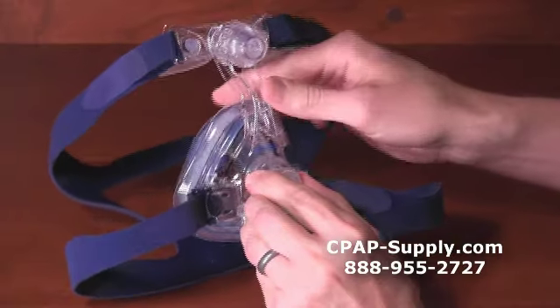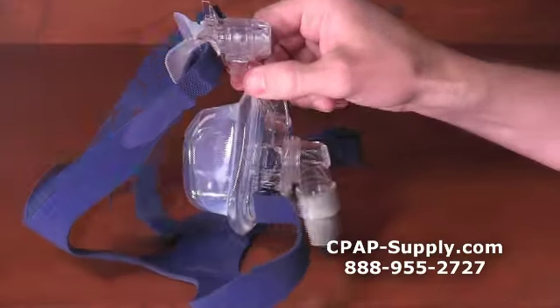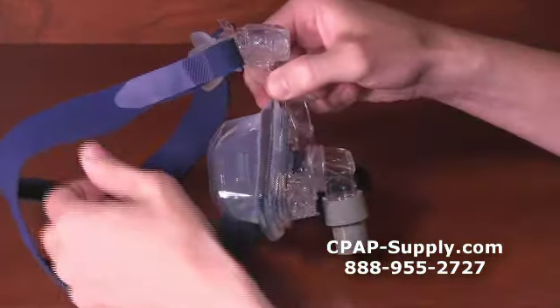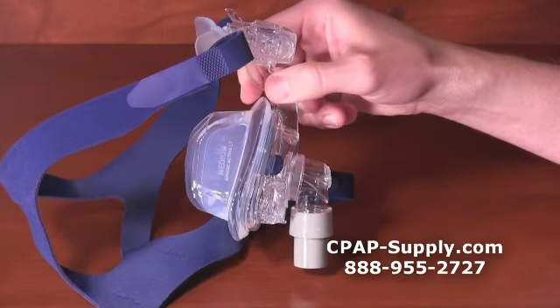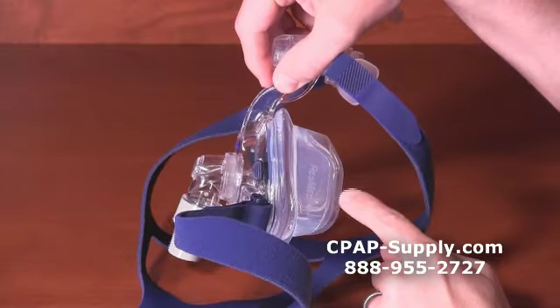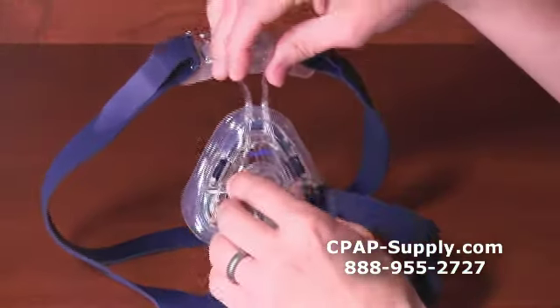The Mirage Activa LT is the first mask in ResMed's convertible series, which offers a choice of two cushion styles on a single mask frame. For the Activa LT mask, the two compatible cushion styles are the Activa LT cushion, which is included with the mask, and the Softgel cushion, which can be purchased separately.